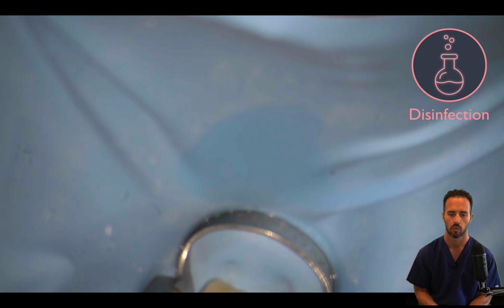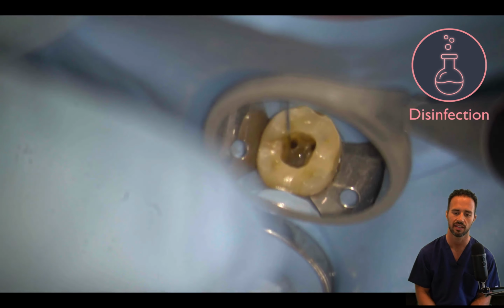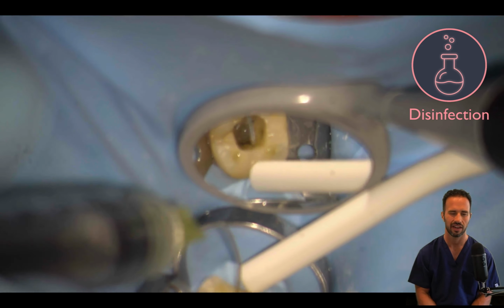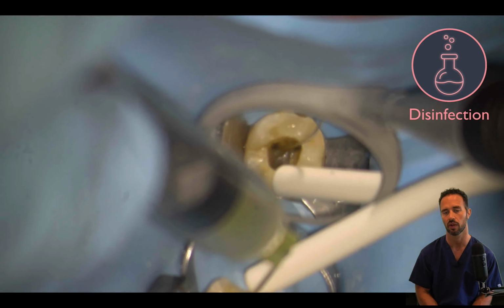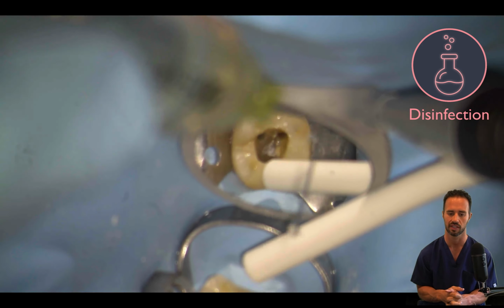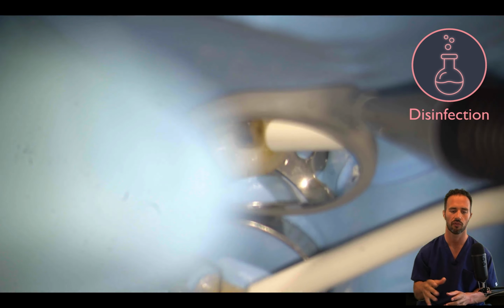Good. 1 minute. And then I'm just going to flush it with the EDTA again and aspirate the EDTA out. And again, you only need about 3 to 4 milliliters of the 17% EDTA. There's no need to fill up a whole syringe. It's quite wasteful, actually. So save yourself a few bucks and don't waste your materials, obviously. And then we're going back in with our final flush of sodium hypochlorite, okay? Half strength, as always, in all 4 of the canals.